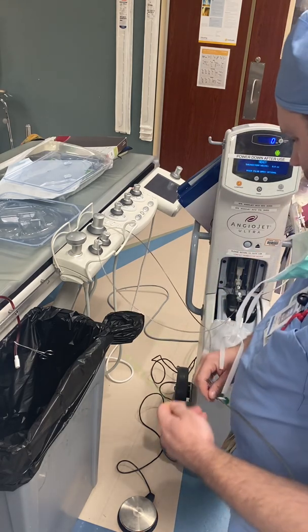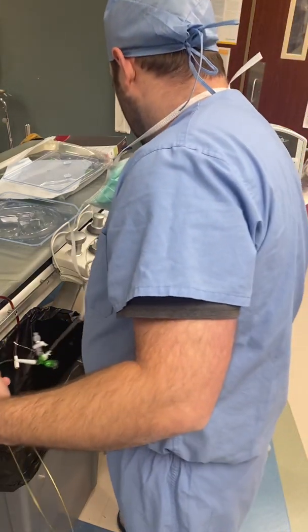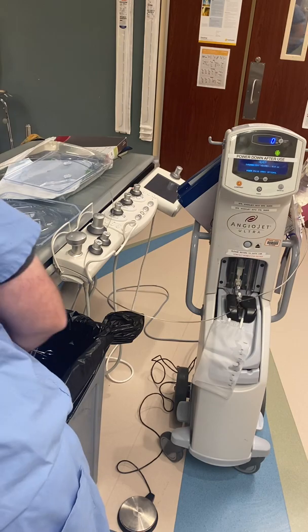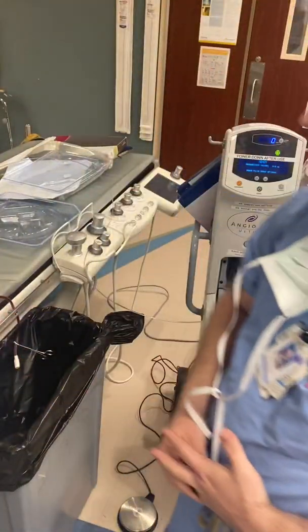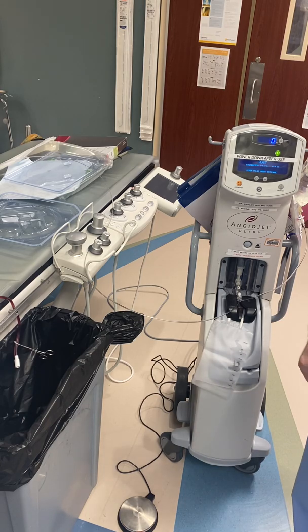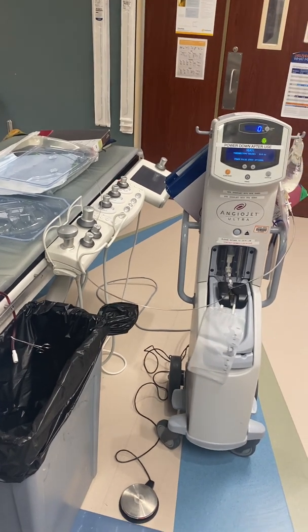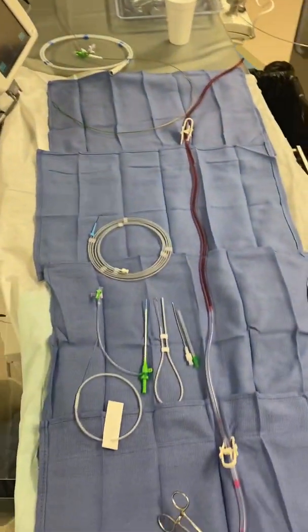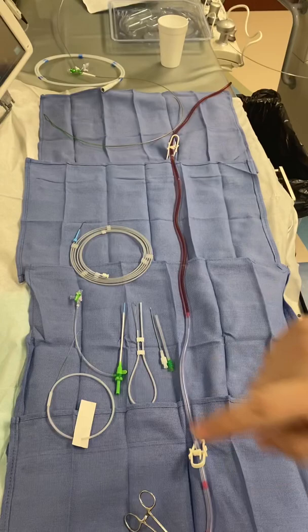At this point you have your catheter and it's ready to go. This one goes over an 0.035 wire — just about all of them do, except they make a distal catheter that goes over an 0.014, and the coronary will also go over an 0.014.